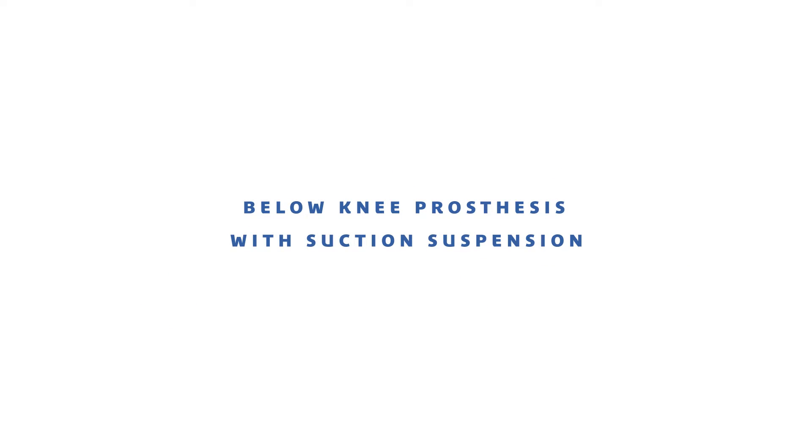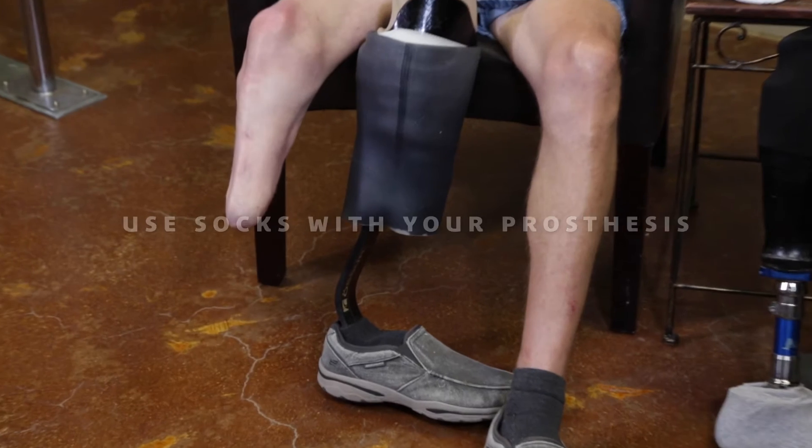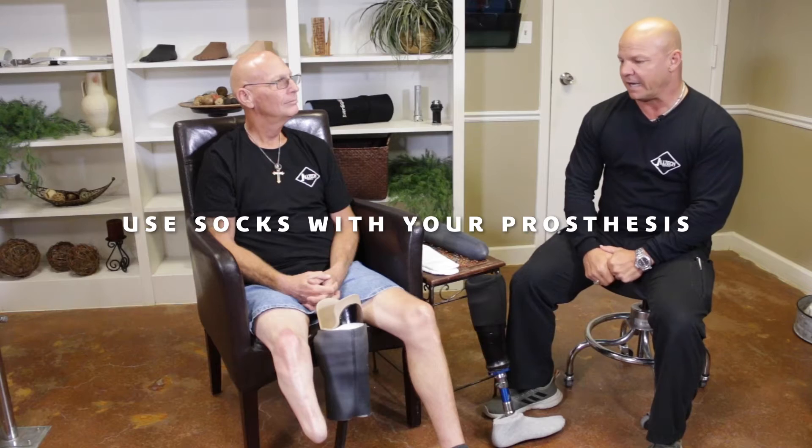This is John. We're going to demonstrate how to put your liners on and use socks with your prosthesis, and roll your sleeve up to seal it with a suction suspension system.